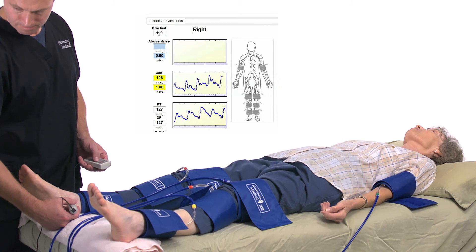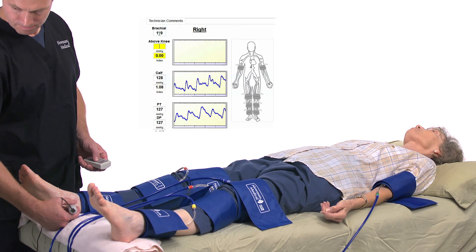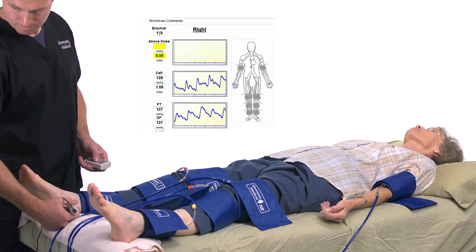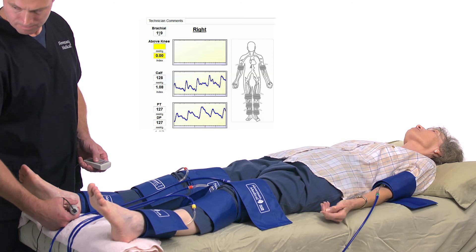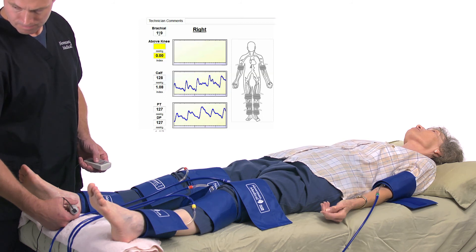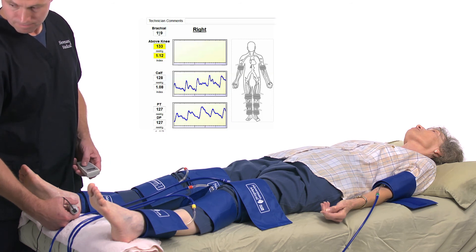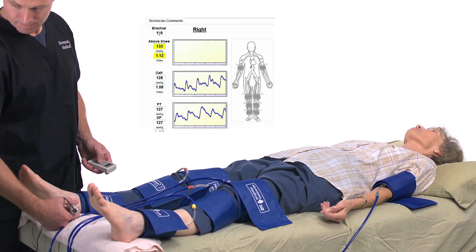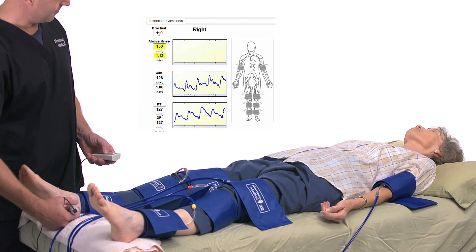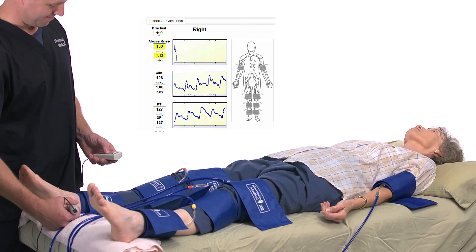When satisfied, push Next and the system will move to the above knee cuff. Again, remember that the pressure depends on the cuff location, not the probe, so keep the probe on the ankle as before. Press and hold Inflate until occlusion, then press Pressure when blood flow returns. Press Dump to prepare to take a waveform, press the waveform button, and wait a few seconds for the PVR waveform to appear.